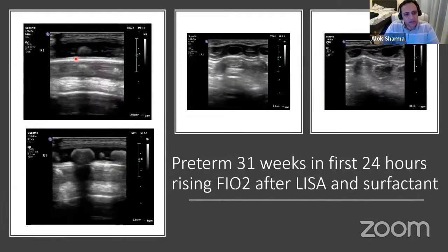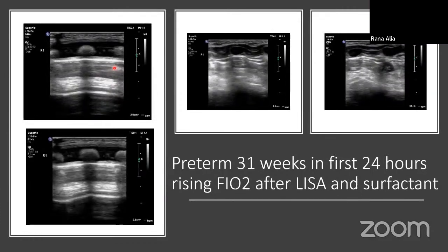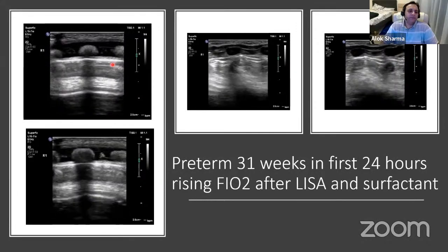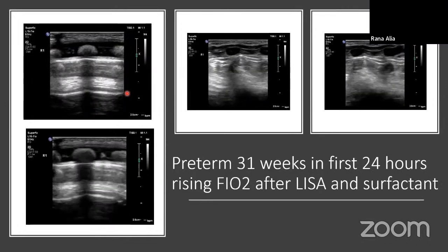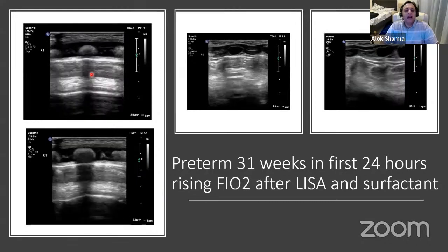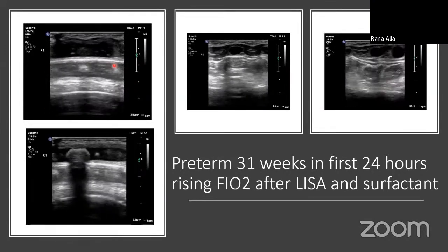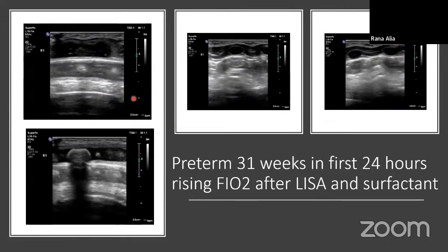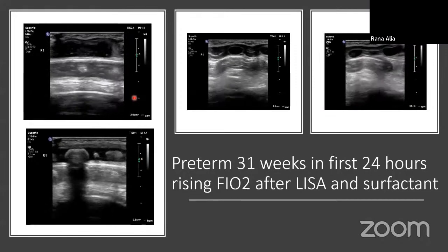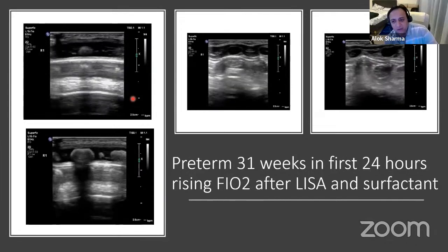Just where my cursor is, do you think they're sliding there? I think there is sliding. Okay, fair point. I can see some comet tails coming and going, just a couple of them, very small. And then you've got A lines. Do you see any B lines? They don't look like the normal B lines we have seen. Completely fair point. Okay, so that's great. Now we're going to get Jean.